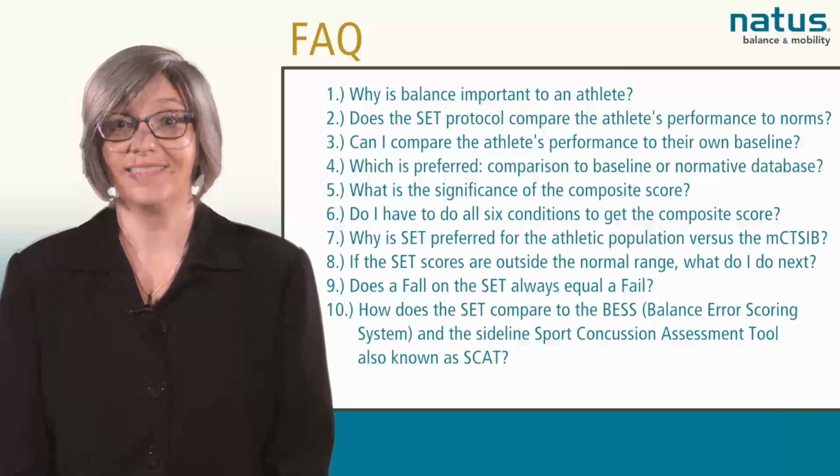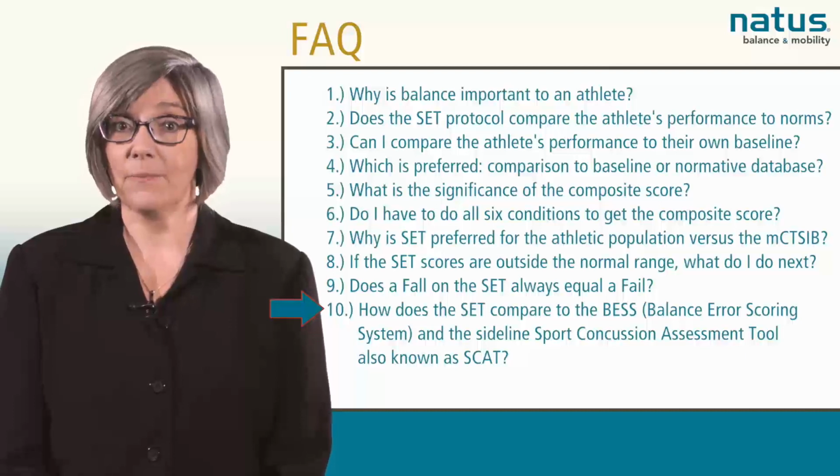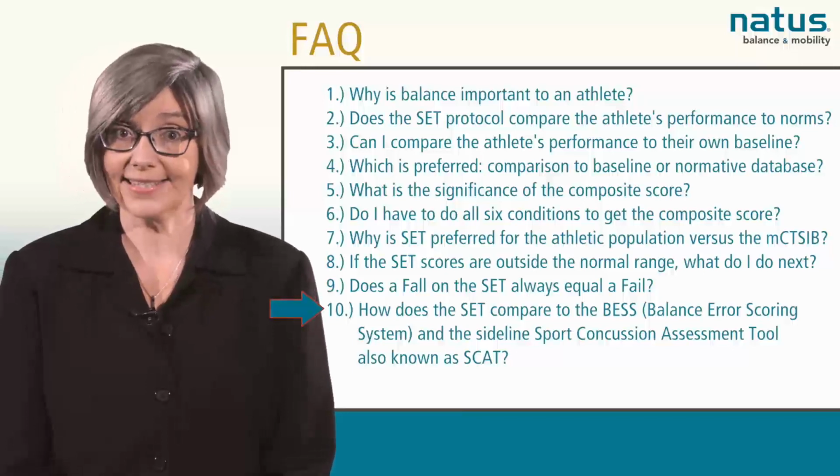The Balance Manager system is measuring both sway velocity and the length of the trial, calculating the score based on both components. How does the SET protocol compare to the BESS, Balance Error Scoring System, and to the Sideline Sport Concussion Assessment Tool, also known as the SCAT?